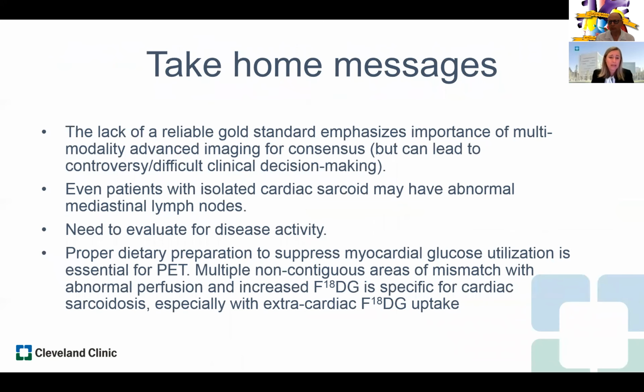So the take-home messages today are that the lack of a reliable gold standard emphasizes the importance of multimodality advanced imaging for consensus. Now, this can sometimes lead to controversy, and it can make clinical decision-making difficult. So seek out your sarcoidosis expert at your institution. They will guide you about which multimodality aspects of imaging can be useful, and making the invisible visible really becomes a lot easier when we're getting different layers of information.